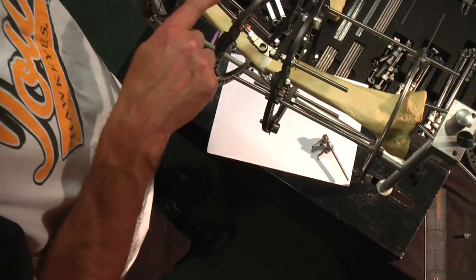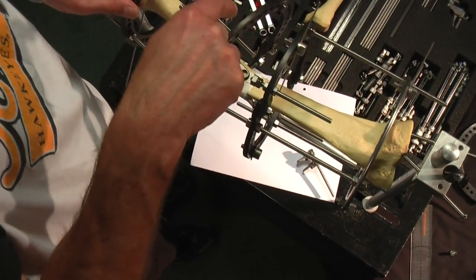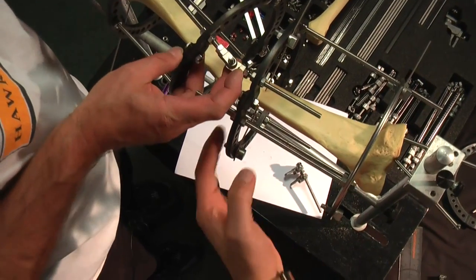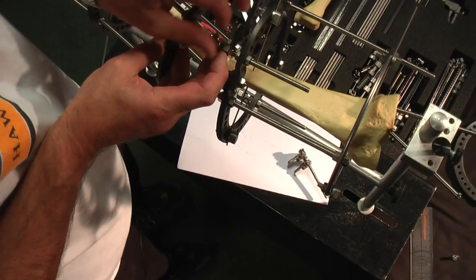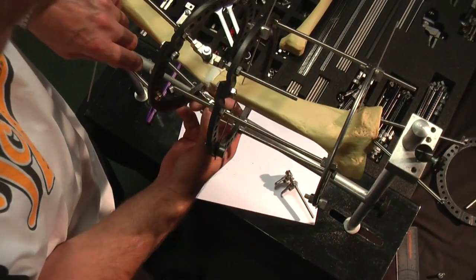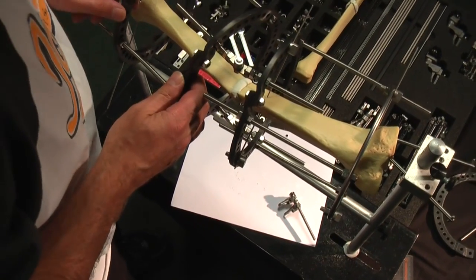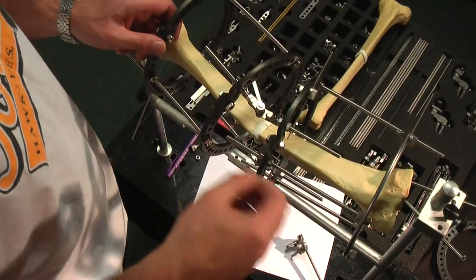All right. We've put an identical hinge in an identical position on an identical ring just below the focus of the deformity. And we're going to bolt that together up there. Okay, and if you look, there's something exactly similar directly behind that where you'd see it on the intensifier. And we said that this needed to be an exact model of this deformity in this bone.